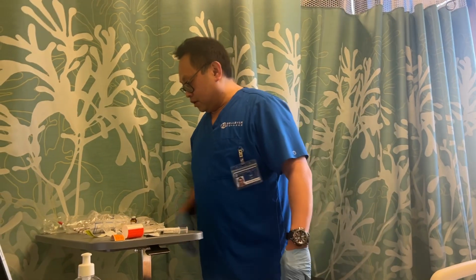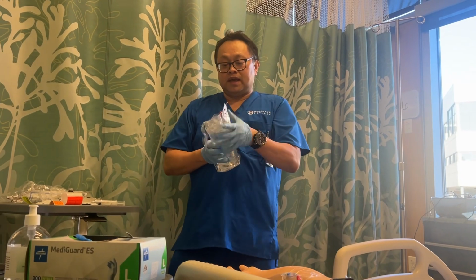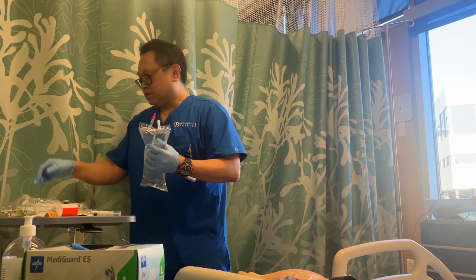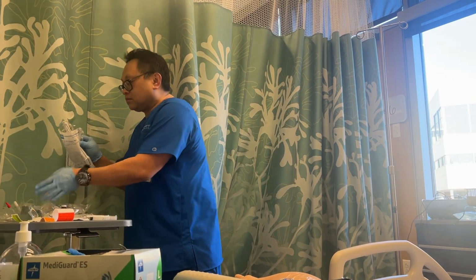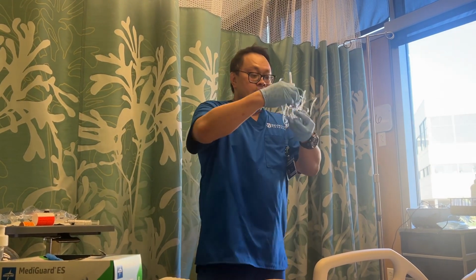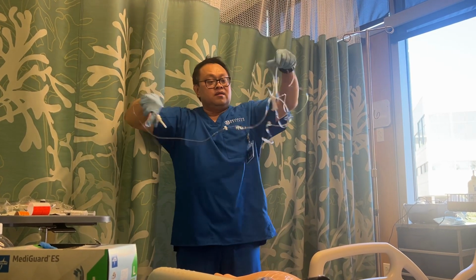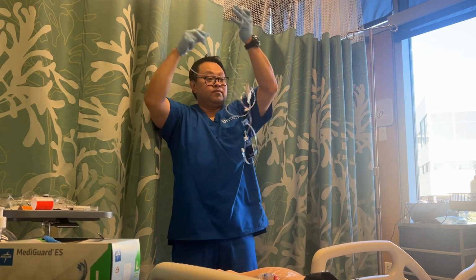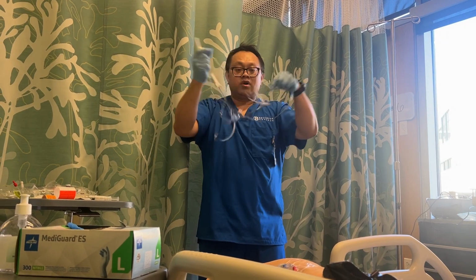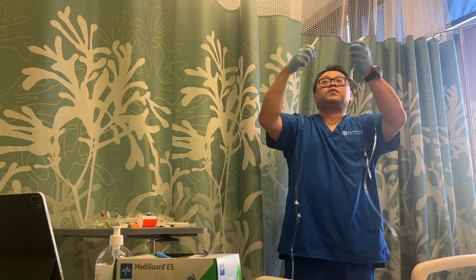Okay, so now I'm going to open my primary bag, checking against right medication, right flow rate, color, clarity. Okay, but before I do that, I can set that aside. The caps are still there, still sterile. I'm going to undo the tubing here, making sure it's not touching anything, the bed or the floor. We want it as sterile as possible. Okay, and it has both the caps on there.